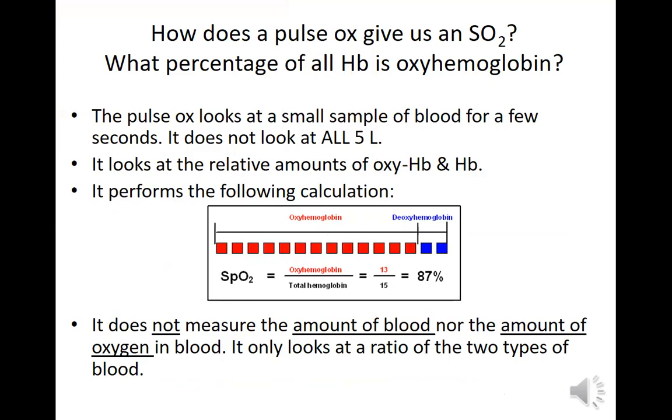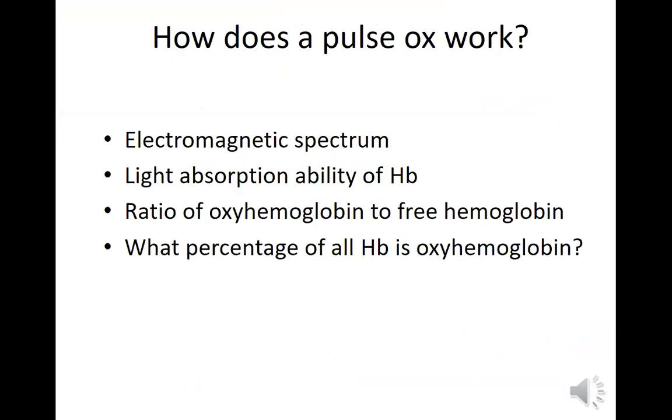That's really important. Because I know for our exam, you had to calculate the FEV1/FVC ratio. So that was normal. This is the total amount of hemoglobin, and that's divided into the oxyhemoglobin. And the machine does that for you. You're not going to have to do that calculation. The calculation you need to do for this lab is the CaO2. So that's really important. At the end, you get the right numbers. And make sure you see what's on the PowerPoint. And again, if you listen to the PowerPoint, be careful. It's very long, but she does make a mistake in the second PowerPoint. And you'll see it when you're going through, and I'll show you here.